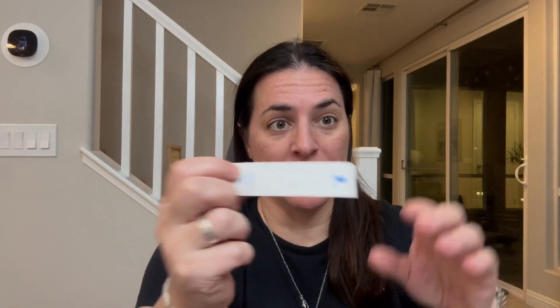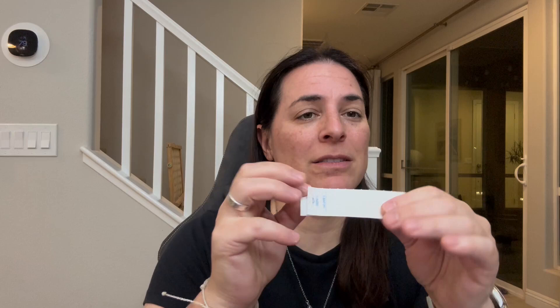Hey everyone, so I got a hundred pack of these disposable digital thermometer probes. I love these things and they help quite a bit with keeping things clean.